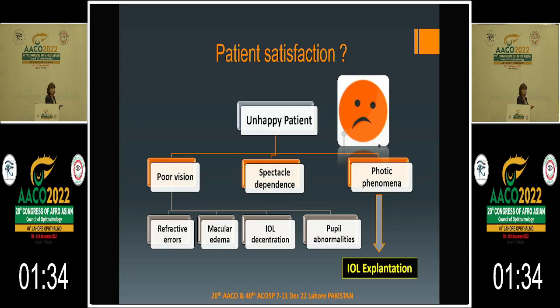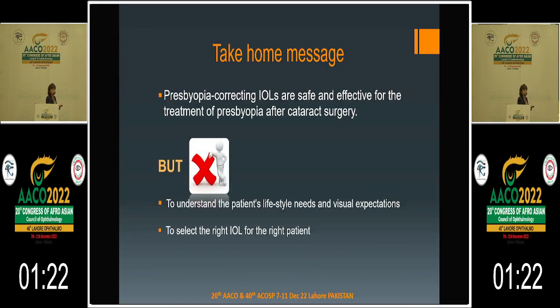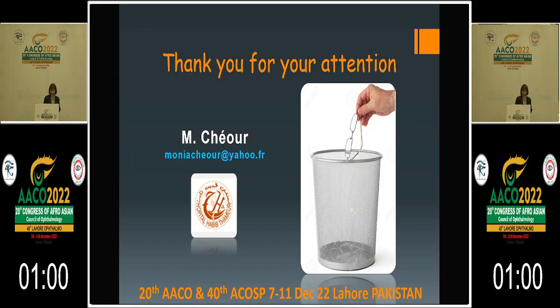So in conclusion, presbyopia correcting IOLs are safe and effective for the treatment of presbyopia after cataract surgery. But we have to understand the patient's lifestyle needs and visual expectations, and we have to select the right IOL for the right patient. Above all, remember that one size does not fit all. Thank you for your attention.